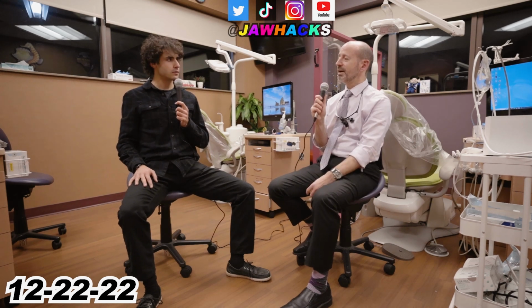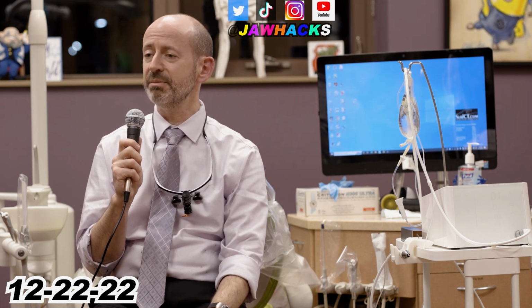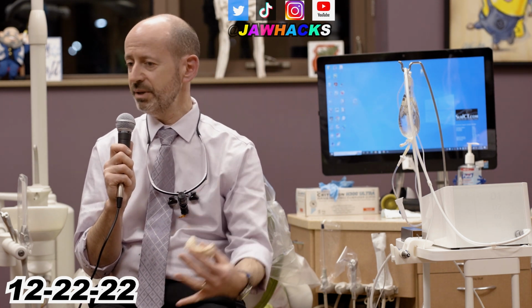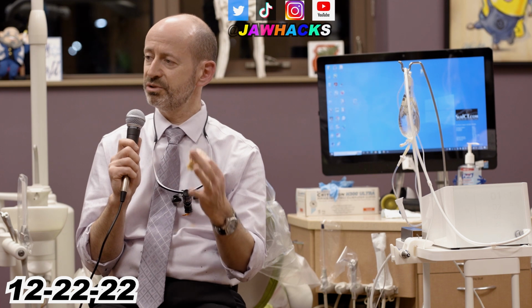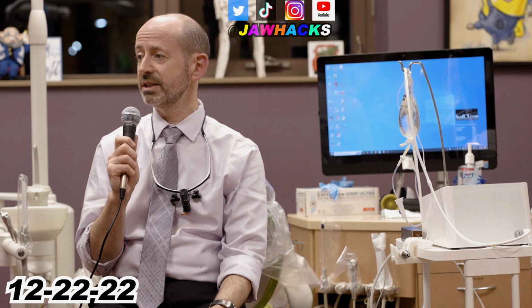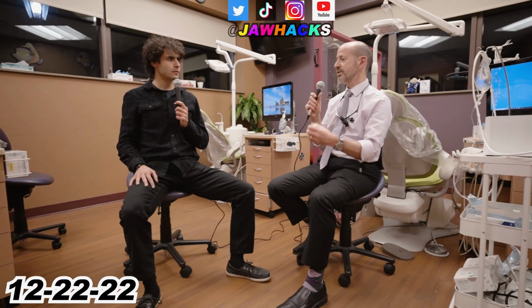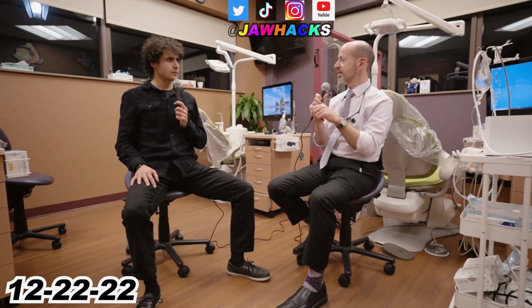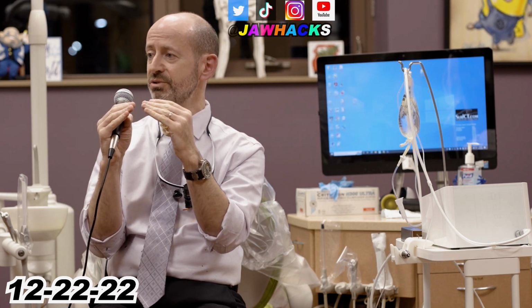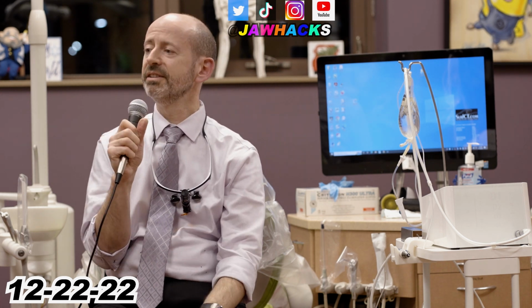Wow. I've had plenty. And I present all my failures. From what I've learned from my own failures, anytime the screws were too far back, and without PIEZO, the bone is just too thin, so it starts to drag. Sometimes I hear people are told to turn 6-8 times a day. This is, to me, insane. If you put in 6-8 cranks and the MSE starts to bend, the minute it starts to bend, because the resistance is too great, you've got your TADs going this way right away, you're done. It's not going to split.